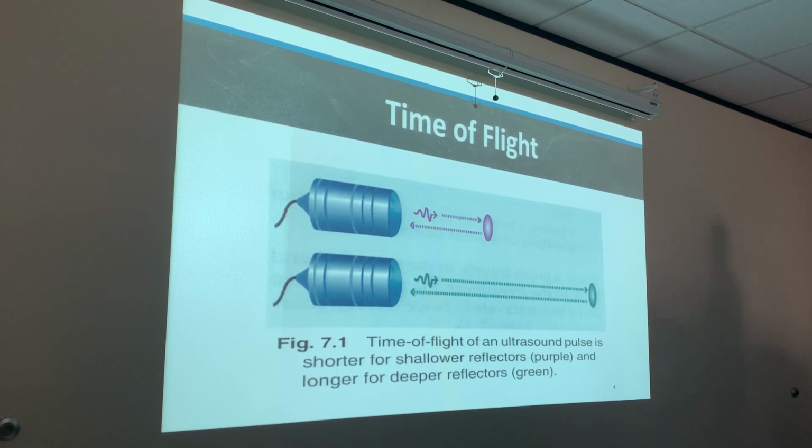And then we're able to send out another pulse, because the ultrasound machine is going to wait and listen for all those pulses to come back. It's not just going to continually send out pulses, because then we'd have those beams colliding and we wouldn't get an image. So it sends a pulse out, waits on reflections to come back, and once we get reflections, it sends another pulse. But that's all based on perfect timing, on the accurate timing of the 13 microsecond rule, or gauging the time of flight.